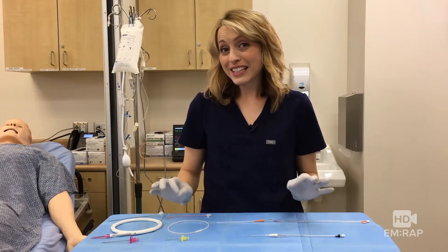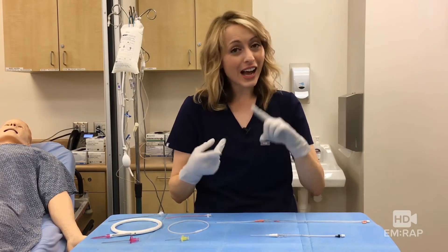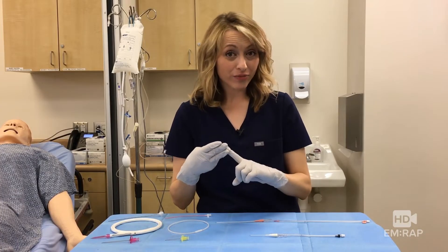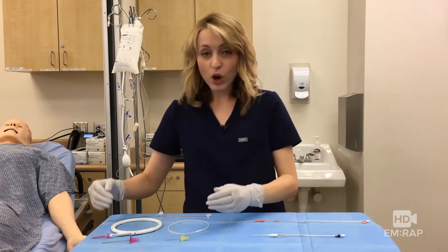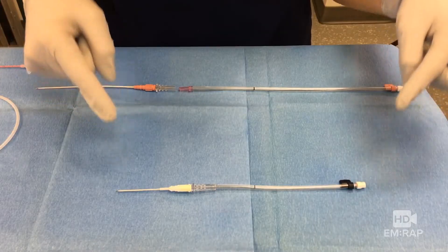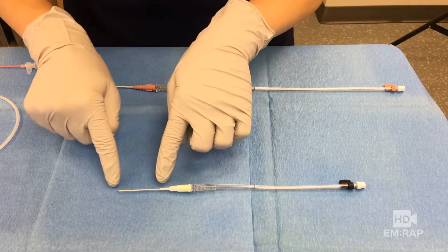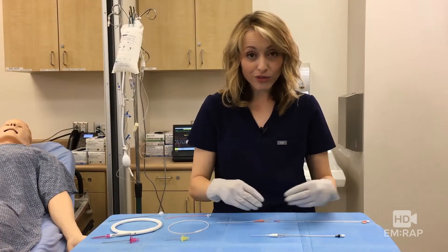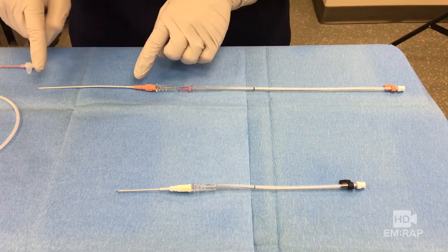All arterial line kits have the same stuff. They've all got a needle, a guide wire, and a catheter. That can come as a single contained unit, like these, or as component parts. This one is for the radial artery — it's 20 gauge, and the catheter is much shorter compared to the one for the femoral artery, which is 18 gauge and a much longer catheter.